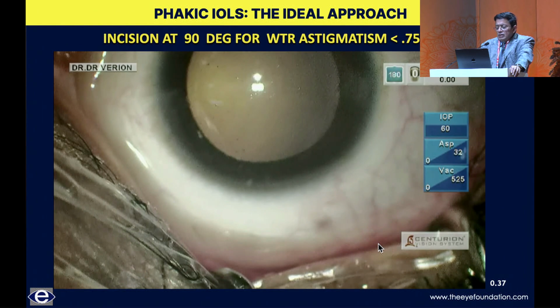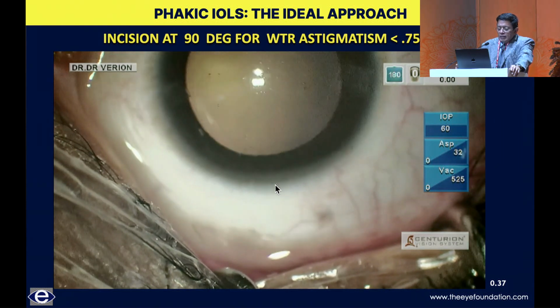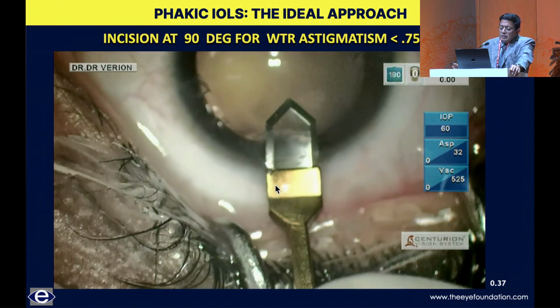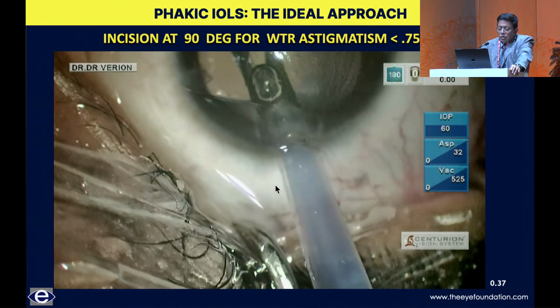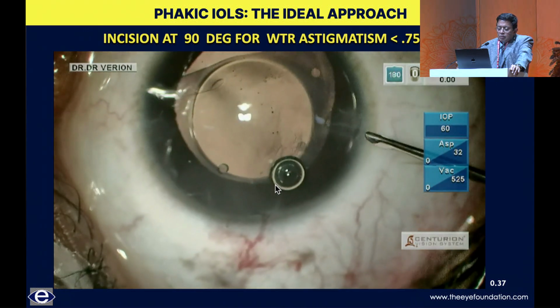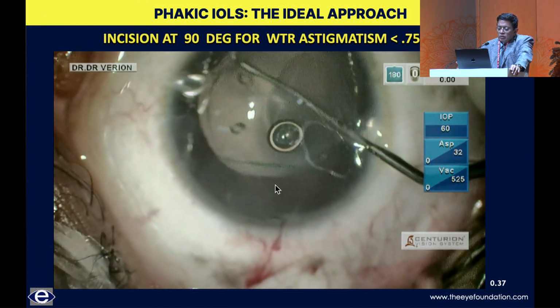Many of these young patients have with-the-rule astigmatism, and in case it's a small astigmatism of about 0.75 diopters or less, I even shift from the temporal to the superior aspect. Since I make a 3 millimeter incision, I find that this gives me a compensation, especially when made superiorly, of almost 0.5 to 0.75 diopters. So you can even implant a spherical lens. Even though the incision is made superiorly, I dial the lens so that it's in the horizontal white to white, because that's how you have taken the measurement. This is a little bit of a cost saving for the patient, and seems to address low amounts of astigmatism quite adequately without resorting to toric lenses.